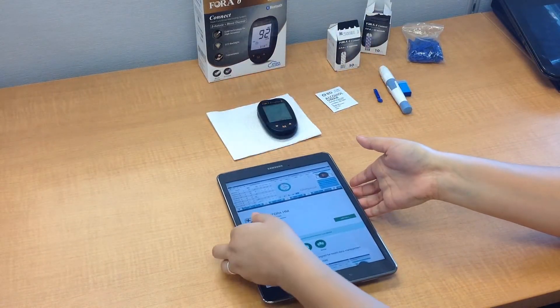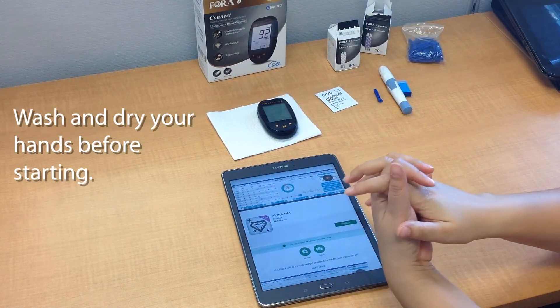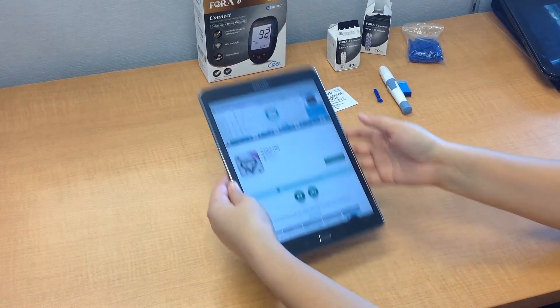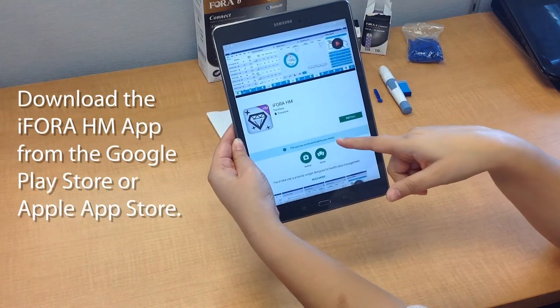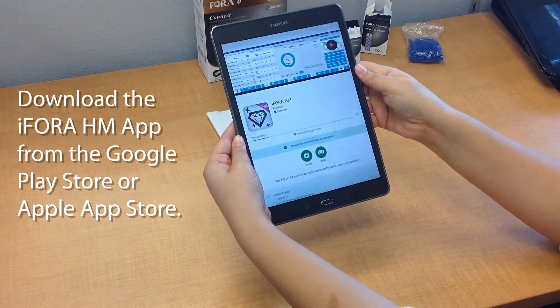Before you start this entire process, please make sure that you have fully washed and dried your hands so that we can avoid any kind of contamination. Also, before starting the test, go ahead and download the iForaHM app from either the Google Play Store or the Apple App Store.